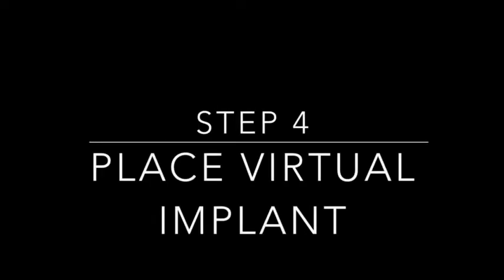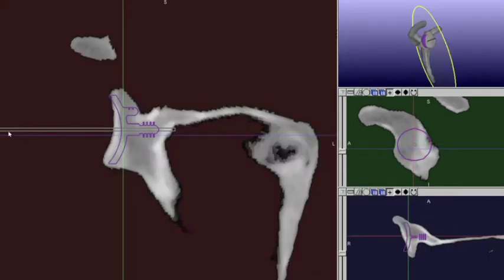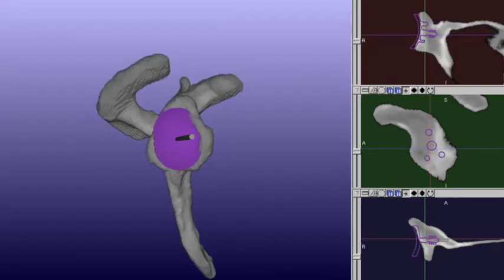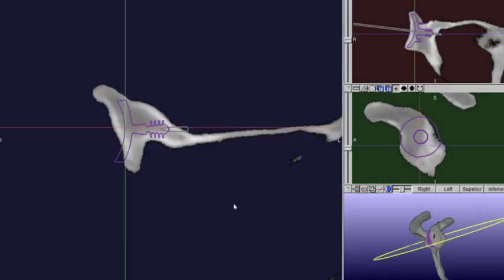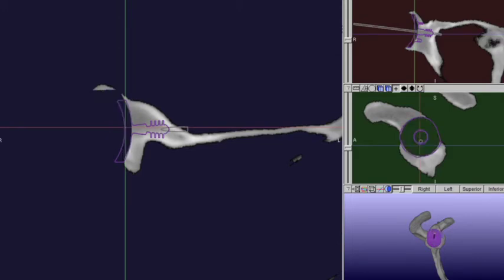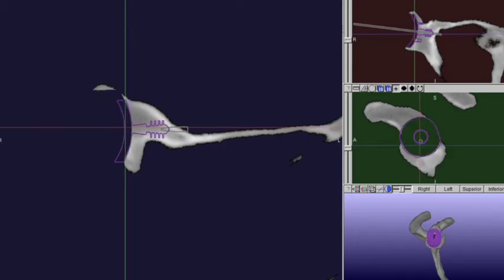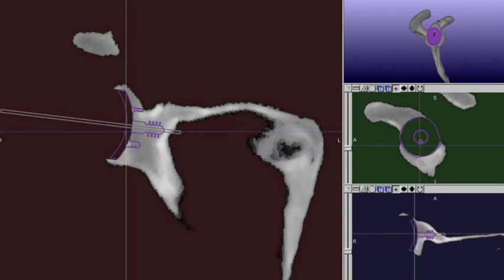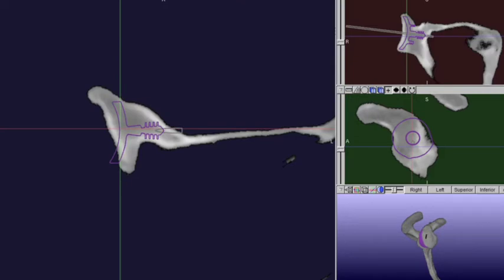Now we place the virtual implant and begin the planning phase. Once the implant is loaded, we choose the appropriate size, version, inclination, and roll to recreate preoperative goals — including restoration of the patient's pre-morbid version, inclination, and joint line position. If we try to recreate an arbitrary version of zero degrees, we see the significant amount of bone that would be removed during reaming and the significant medialization of the joint line. Literature shows that removal of subchondral bone increases the risk of glenoid loosening, and medialization likely detensions the rotator cuff, increasing anterior-posterior translational motion of the humeral head and the risk of loosening.